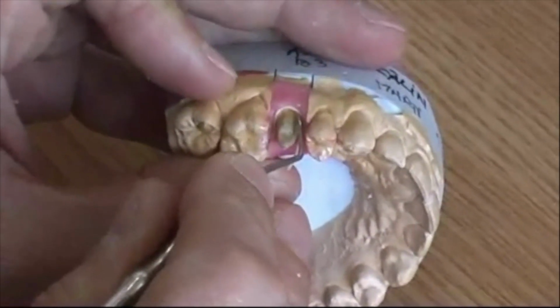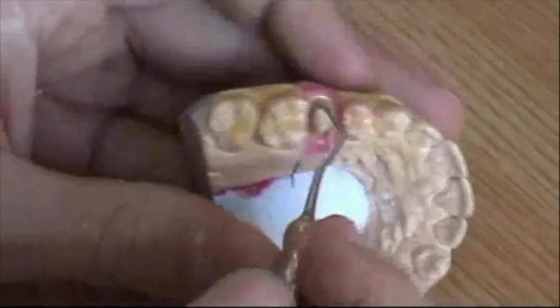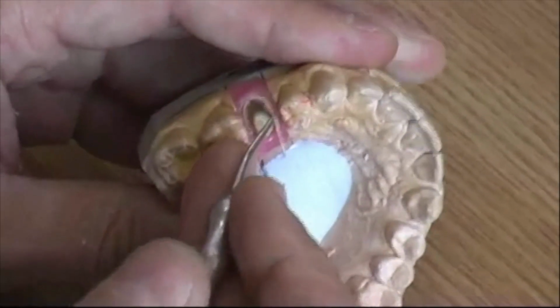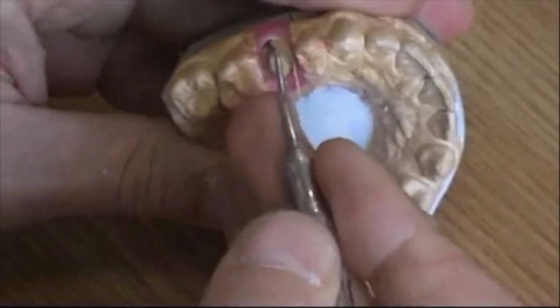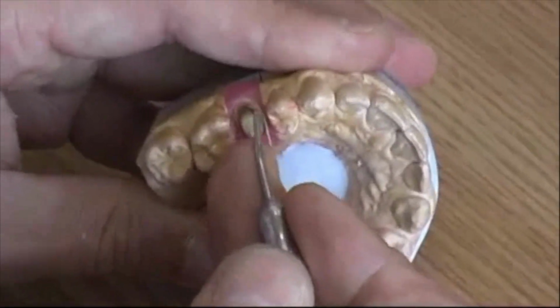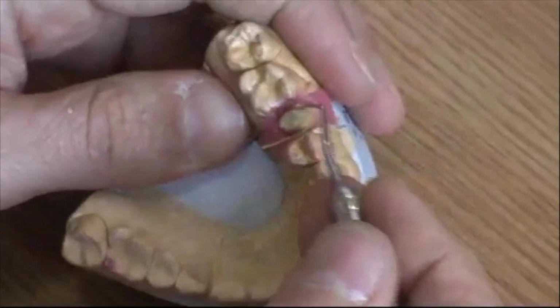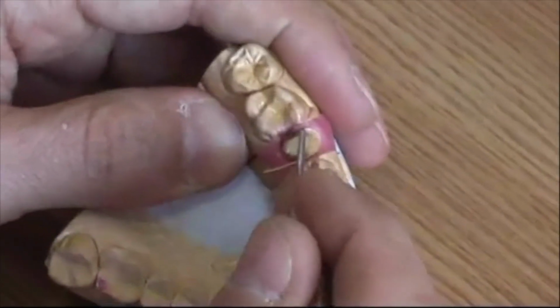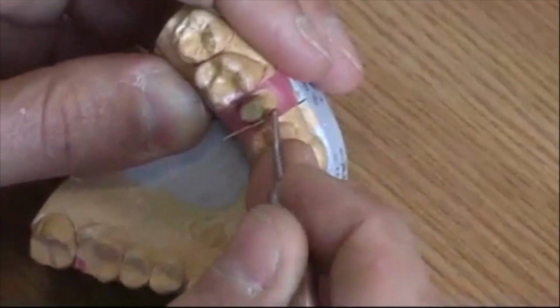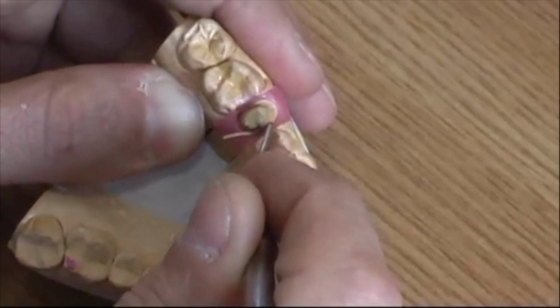Actually, what we're doing here, we're pushing a little bit the gum away. Not too much, because if you push it too much, and if it hurts, and if the patient says, stop, then no, please don't, then you have a problem. And to do an anesthesia and to press it even more, the patient doesn't feel, but then your gum will retract, because you just over pushed the retraction cord. So the retraction cord is to be placed nicely, almost without anesthesia. And don't push it too much, because the gum will retract and you will have short crowns.